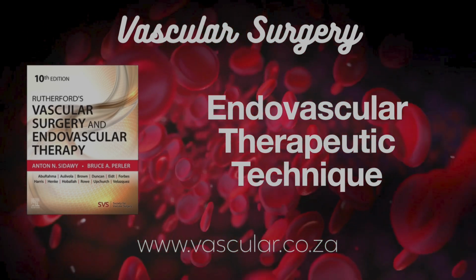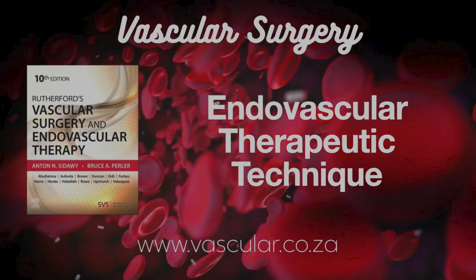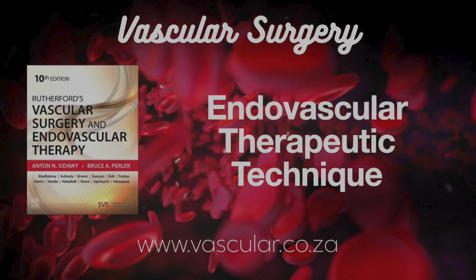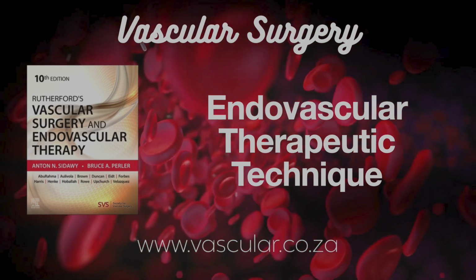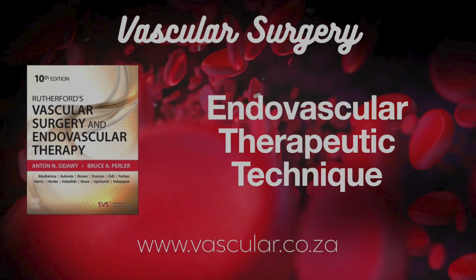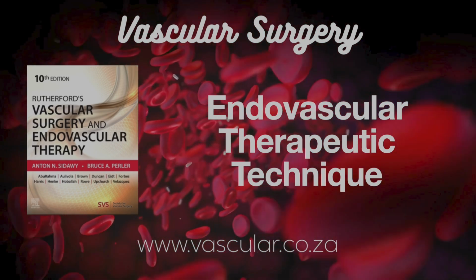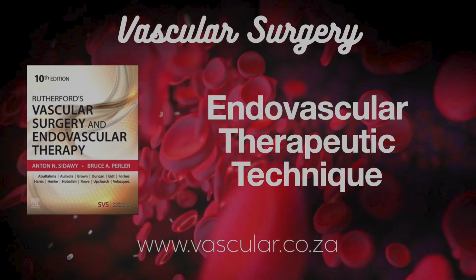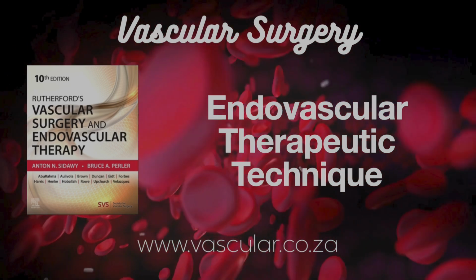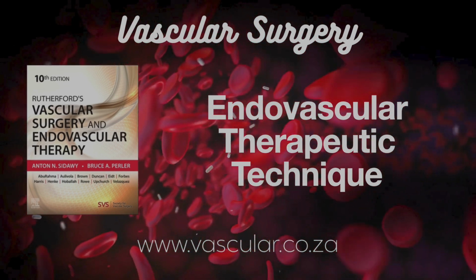The source also mentions open cell versus closed cell designs in SES. Functional differences. Yeah, that's about the architecture of the stent mesh. Open cell stents have struts forming larger, more open spaces. Gives them high flexibility, great for tortuous vessels. But downsides? Can be more prone to deformation, maybe less uniform radial force, and potentially plaque could bulge through the bigger openings. Closed cell stents have a tighter mesh, smaller interconnected cells. Better scaffolding? Less embolization risk? Potentially less embolization risk. Yeah, the finer mesh might trap debris better. But they tend to be less flexible, might not conform as well to very curvy vessels. So a trade-off again? Exactly.